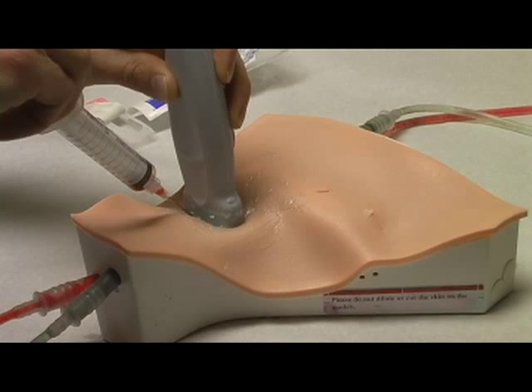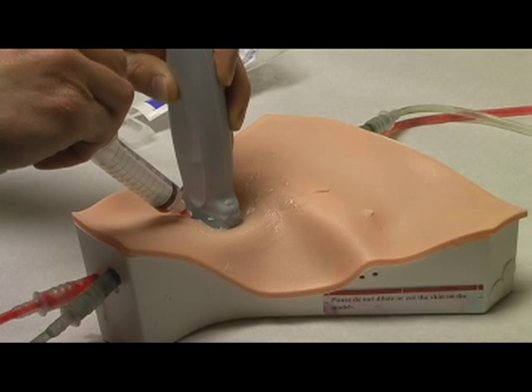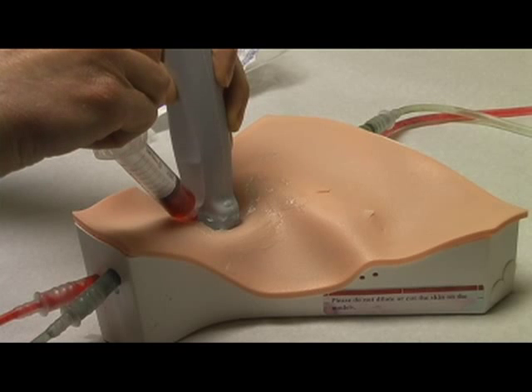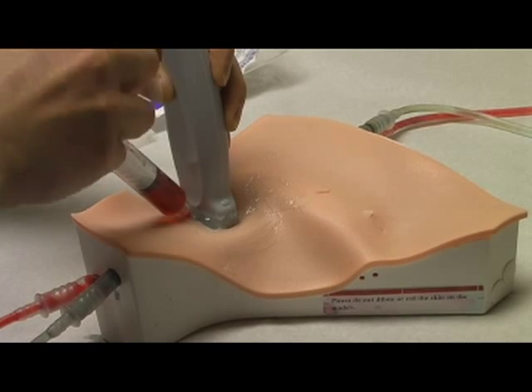So demonstrating here, one of the effective aspects of this model is that if the student is in fact wrong and cannulates the artery, the bright red fluid will indicate that they are wrong.